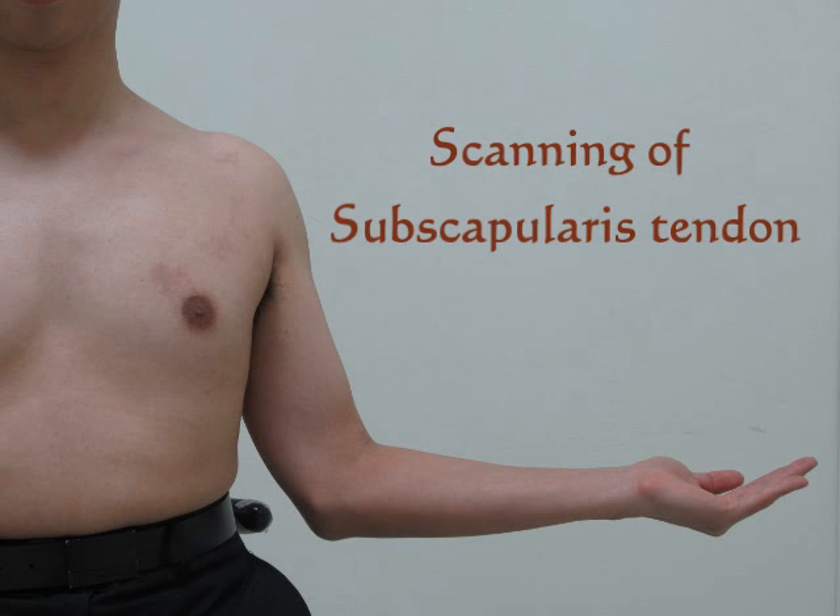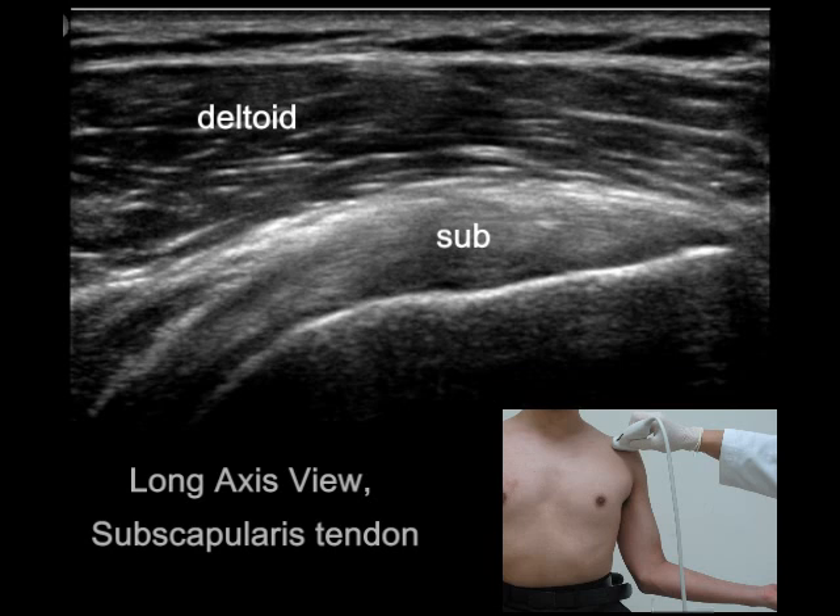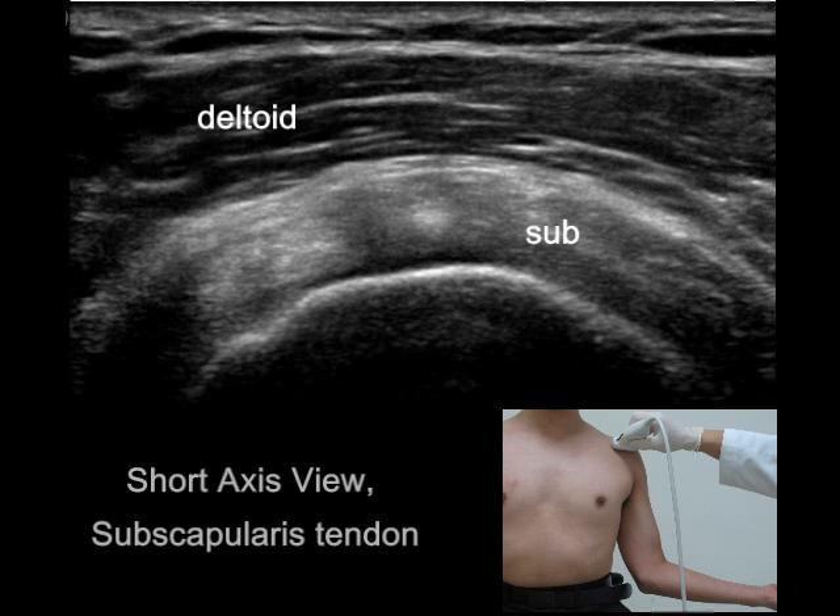Long axis view of the subscapularis tendon is best demonstrated with the patient's arm in external rotation. The tendon is then pulled laterally and anteriorly for scanning. As we rotate the transducer 90 degrees and make it perpendicular to the ground, the short axis view of the tendon can be imaged.